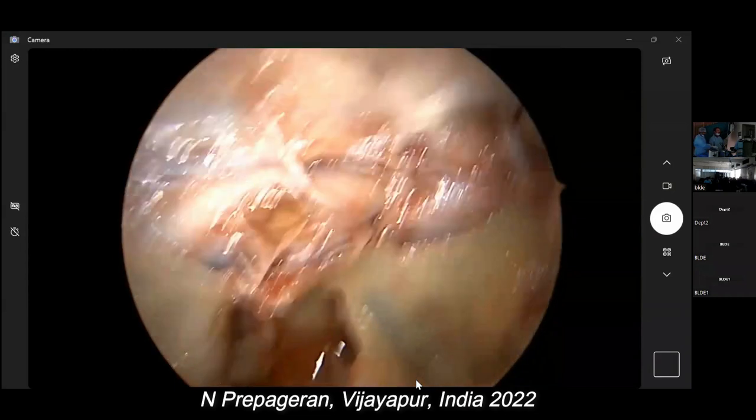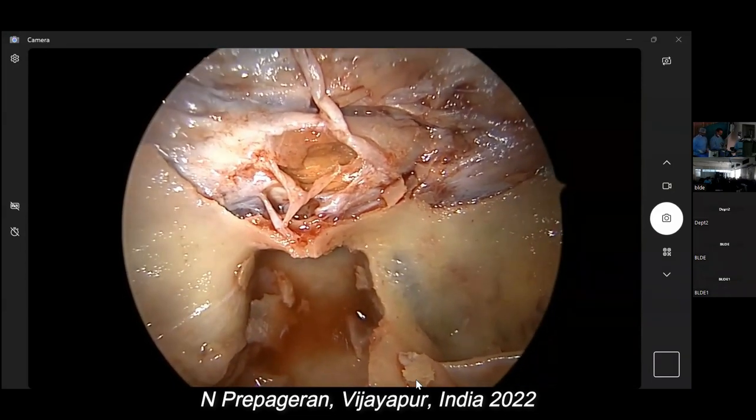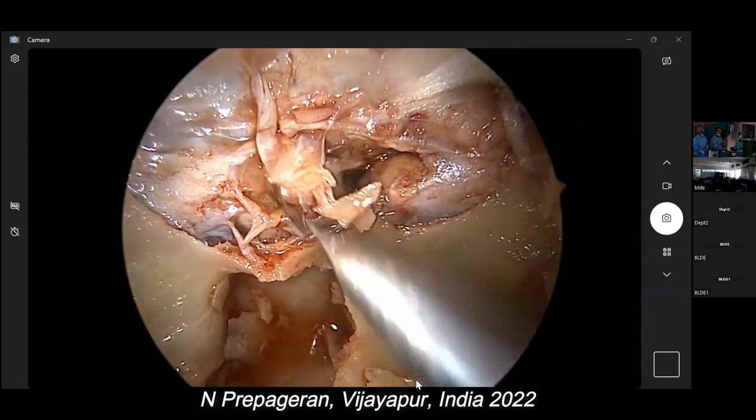Okay. Tumor out. Okay? Thanks. Now we go on to suprasellar. So what I'm going to do now is separate the pituitary gland from the carotid artery.